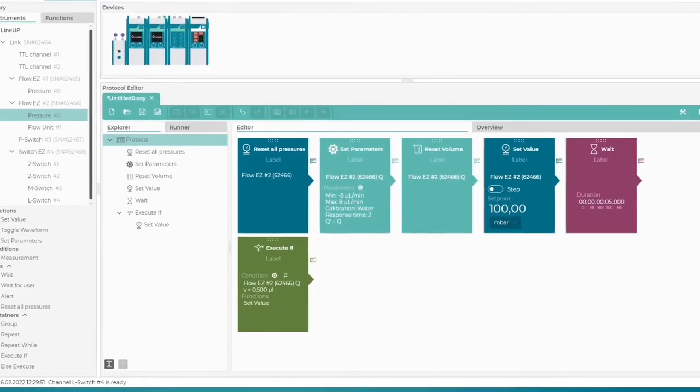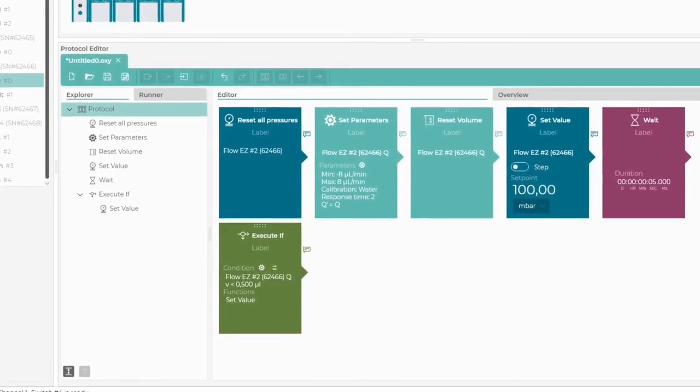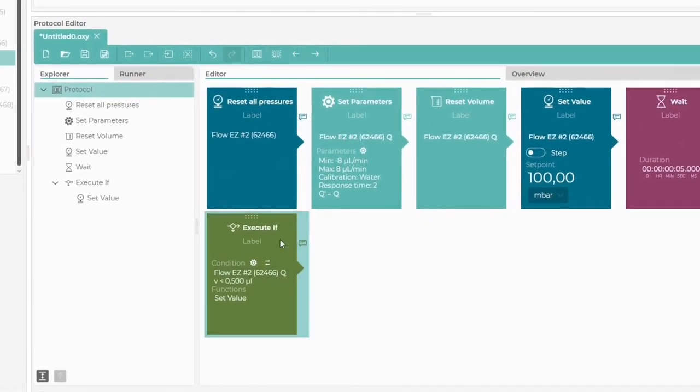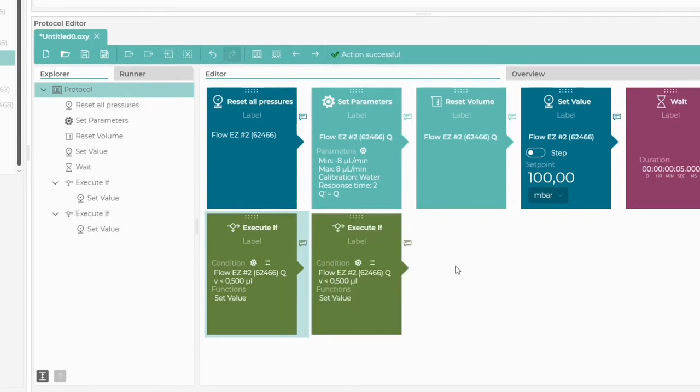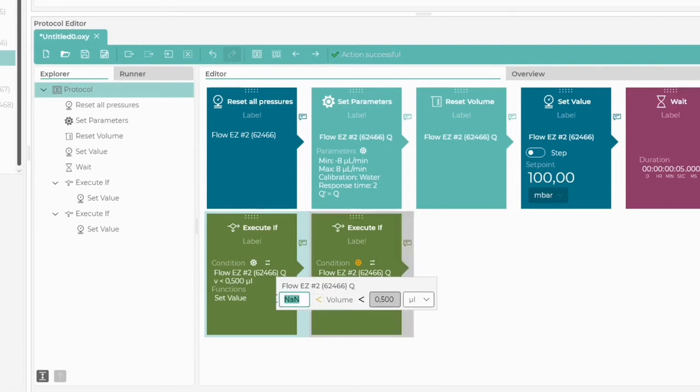To create the second condition, we simply copy the first Execute If block and change its parameters. This time, we want the volume to have an upper limit above which the pressure will be reduced.